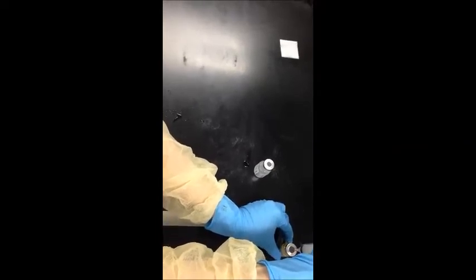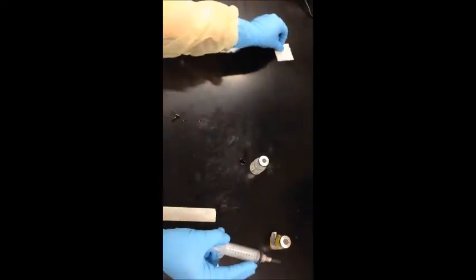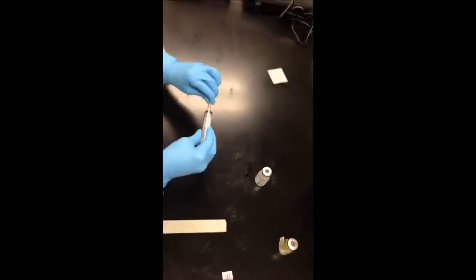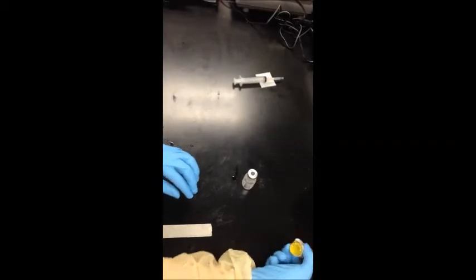Remove syringe and place on alcohol pad making sure the needle tip is facing towards first air. Invert medication vial back and forth until the powder has been dissolved. This may take a few minutes.